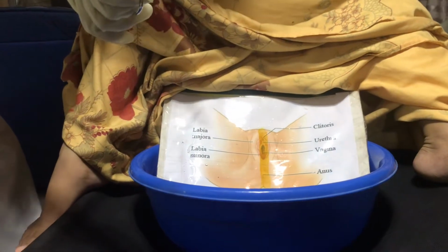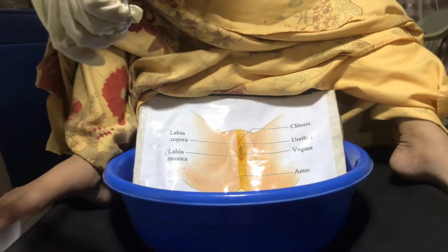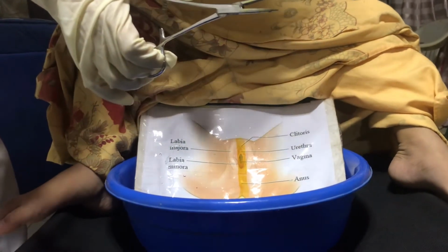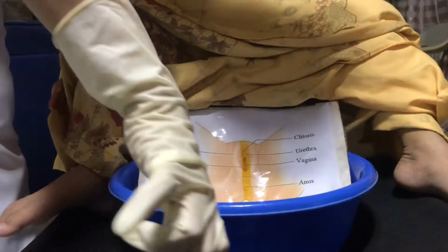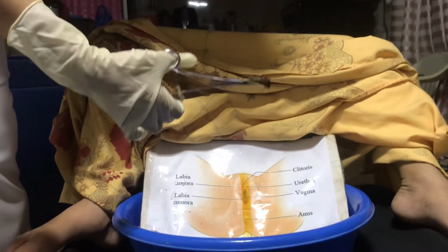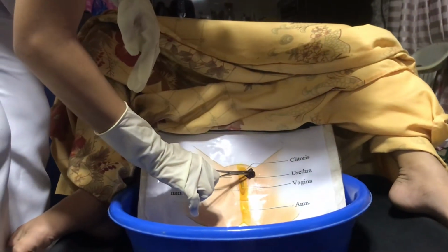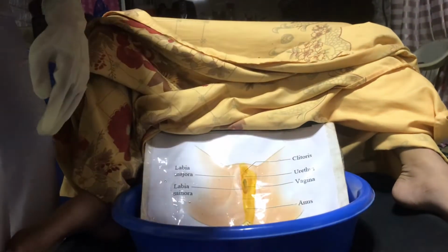Next is with the second cotton ball, cleanse starting from mons pubis in a figure of 7 by way of the external labium towards the anus. So we're going to still get the second cotton ball and do the figure of 7. Start it here, then down to the anus, then discard.